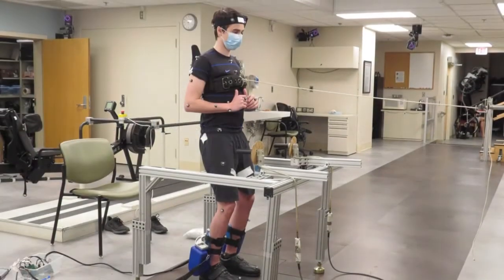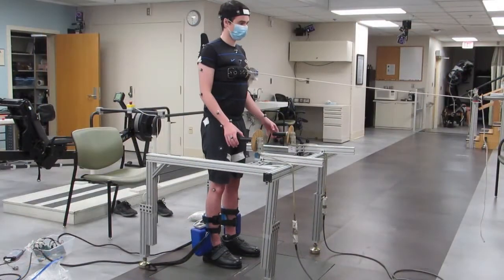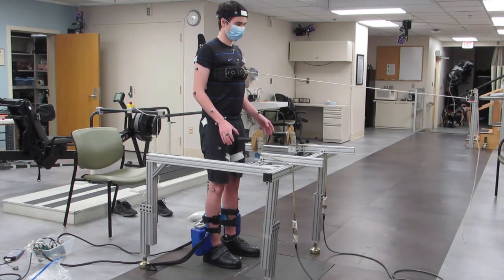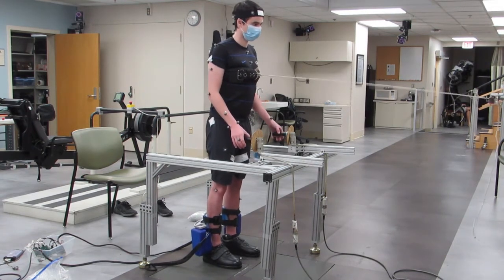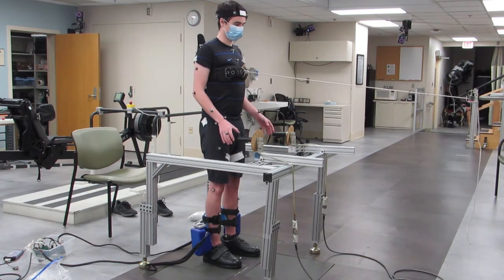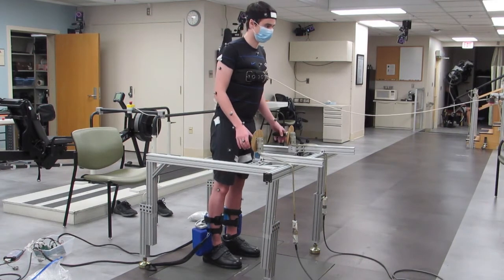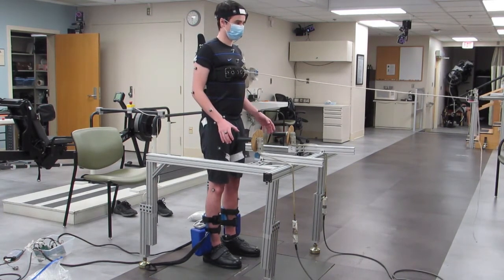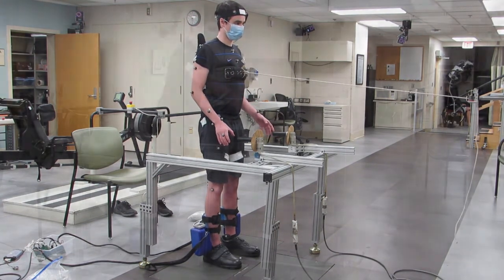Additionally, we have been evaluating perturbation responses with able-bodied study participants. The actuated ankle joints are controlled by a simple PD controller tuned to maintain an erect standing position. In these destabilizing experiments, the participant is pulled in the forward direction by a linear actuator, while the PD controller helps counteract the perturbation. We prescribed 3 separate perturbations with magnitudes between 3 and 5% body weight. The study participant does not know the magnitude or time of the next perturbation.